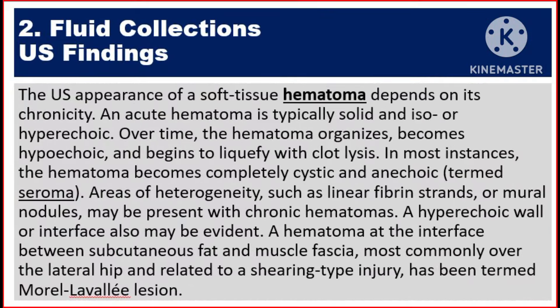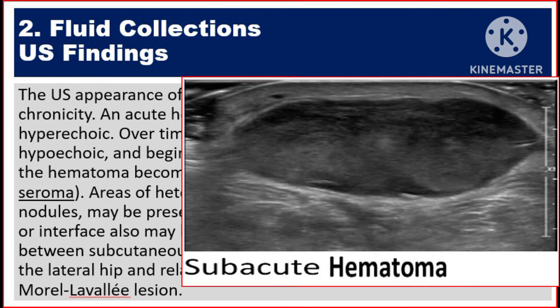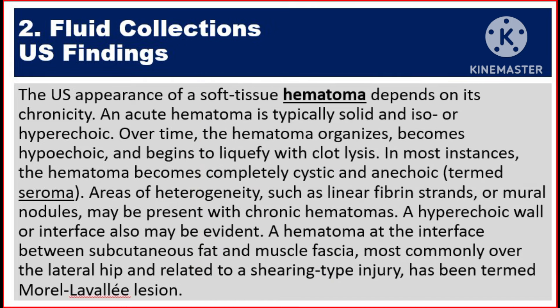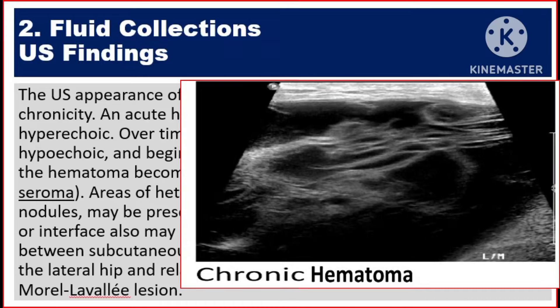The ultrasound appearance of a soft tissue hematoma depends on its chronicity. An acute hematoma is typically solid and iso- or hyper-echoic. Over time, the hematoma organizes, becomes hypo-echoic, and begins to liquefy with clot lysis. In most instances, the hematoma becomes completely cystic and anechoic, termed seroma. Areas of heterogeneity, such as linear fibrin strands or mural nodules, may be present with chronic hematomas.